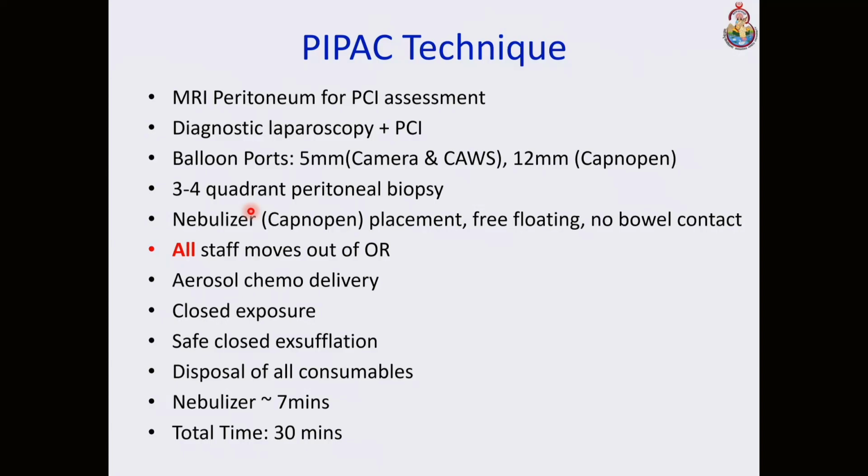No adhesiolysis is permitted, because if there is a serosal tear in the intestines while doing adhesiolysis, PIPAC can result in perforation. So all that need not be done. And then we put in this nebulizer, or the Capno pen, which should be free floating inside the abdominal cavity with absolutely no bowel contact.